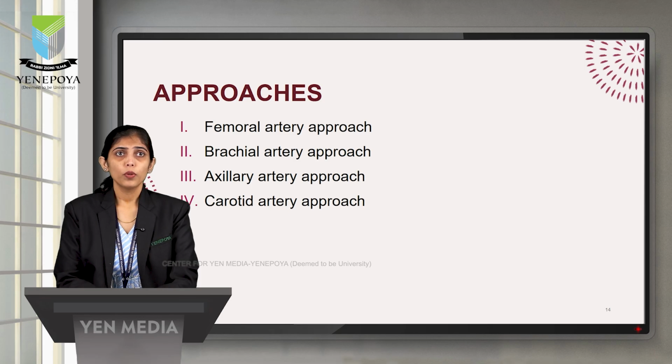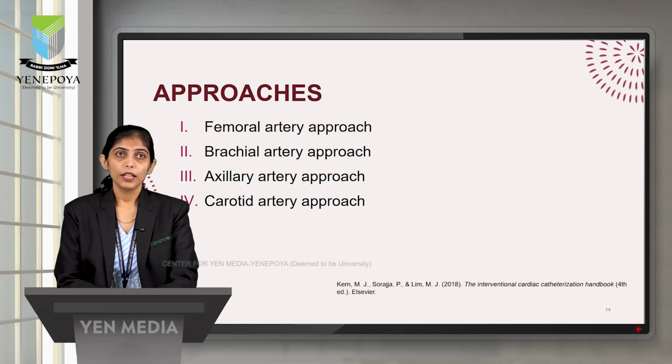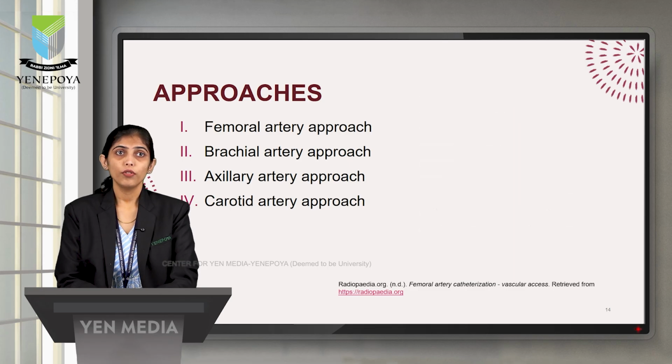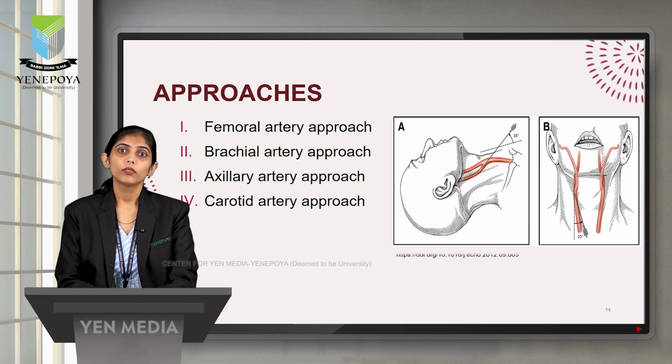Coming to the approaches, we have four types of approaches. We have the femoral approach, which is the most common one as it is easily accessible to the site. Then we have the brachial artery approach. Then we have the axillary artery approach and the carotid artery approach.